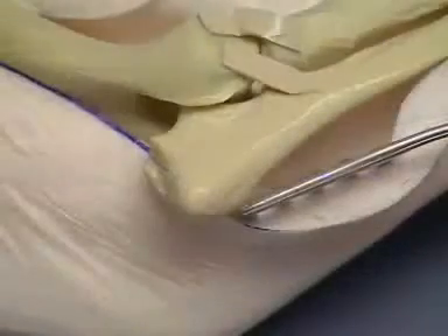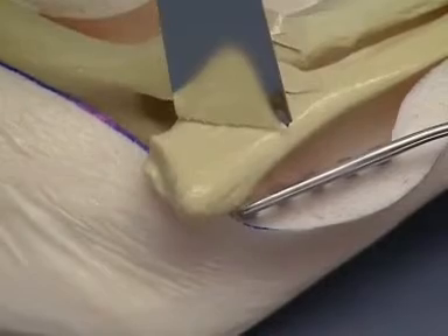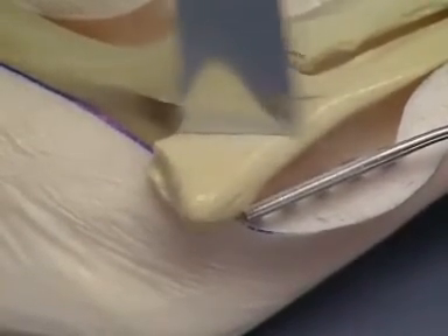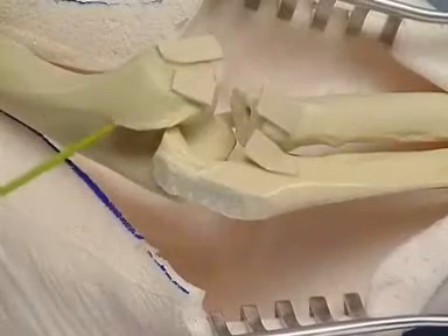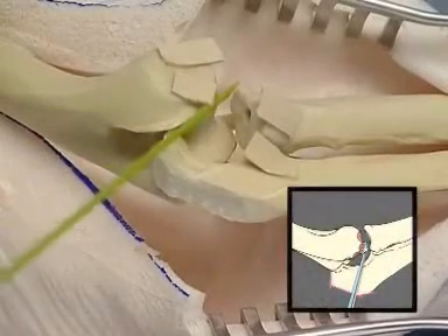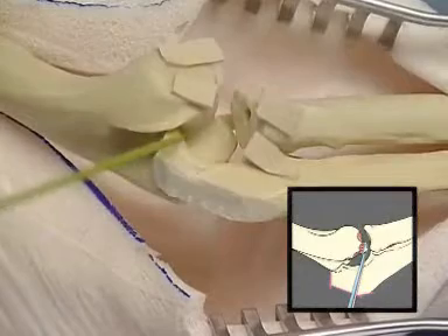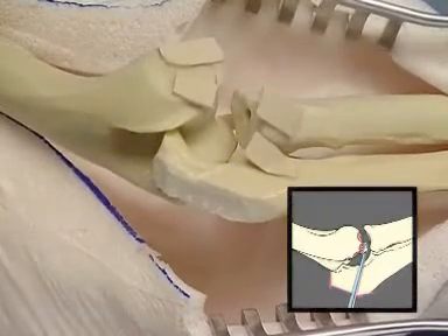The olecranon is osteotomized to aid joint exposure and provide a flat surface for the plate. In a clinical case, the articular cartilage of the humerocondyle, radial head, and trochlear notch is thoroughly removed with a bone curette or high speed burr.